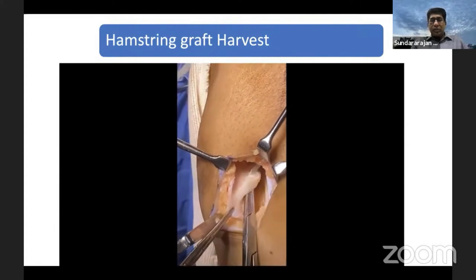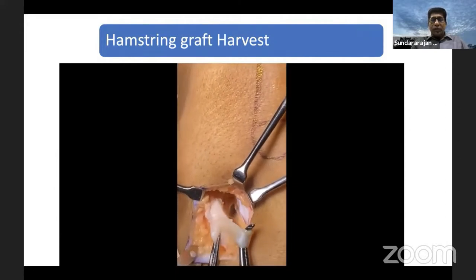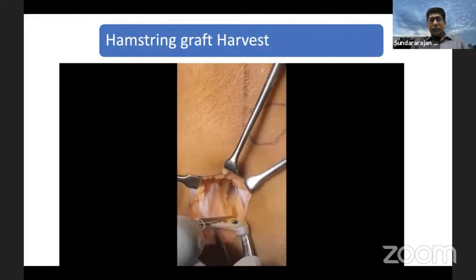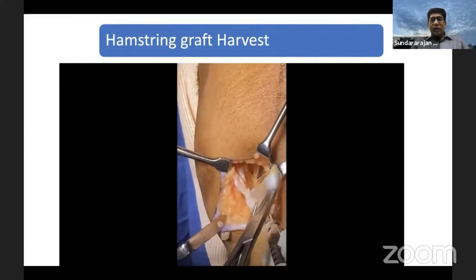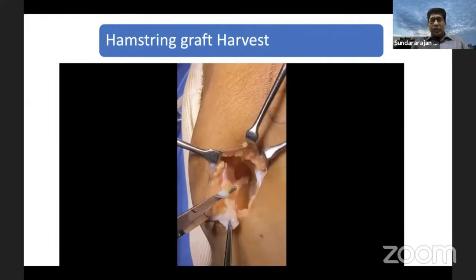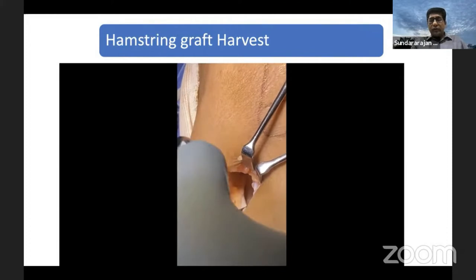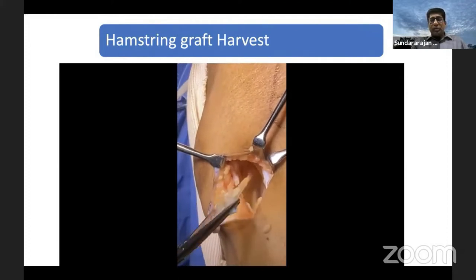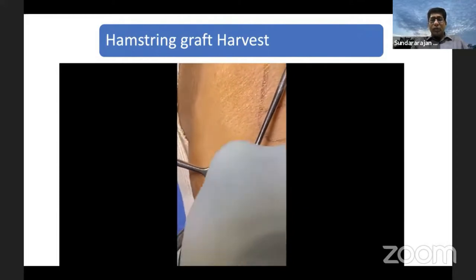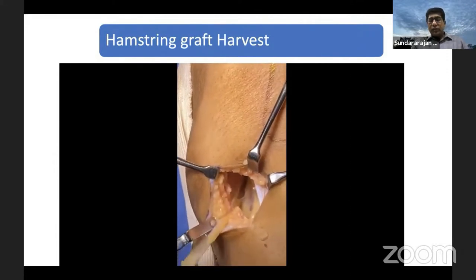Here I am taking the semitendinosus first. You use a right angle to go around it, then pull it out. Then you can use a size 10 knife to take the distal attachment of your semitendinosus from the Pes Anserina, and it comes almost up to the bone level. So you have enough length of semitendinosus when you take it through this technique. Once you take it out, then you can take out the vinculi. There are two to three vinculi underneath the semitendinosus. Sometimes when you pull it up, one or two vinculi can get cut. Otherwise you can use scissors facing downwards to release the vinculi and all the attachments, then free your semitendinosus.